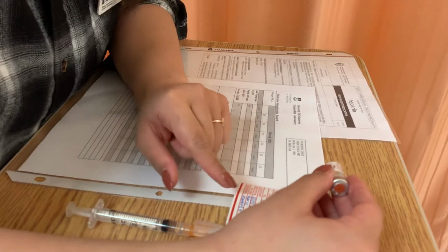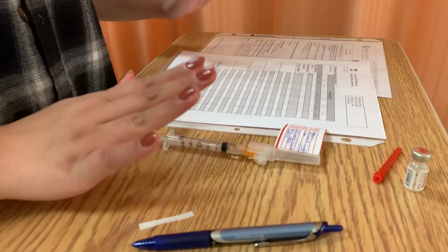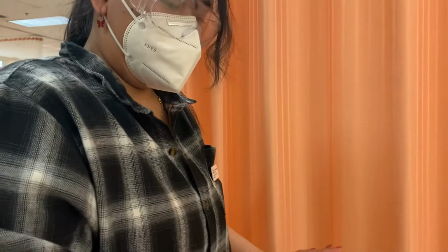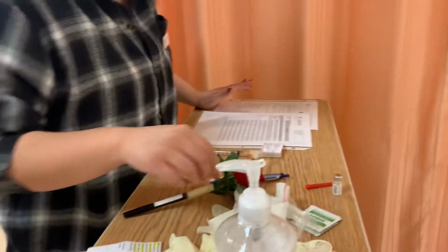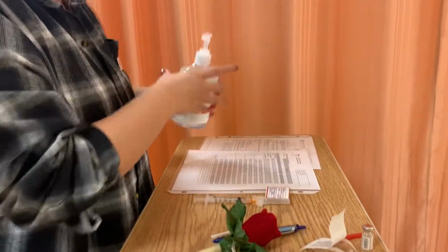Twice a day. Current time is 9 a.m. so I can put it in the 9 a.m. slot. Perfect. Okay, so now that I've done that check, I'm going to go to the patient's table. I'm going to first put these away. Okay. And I have my cotton buds there. I just need to do this.